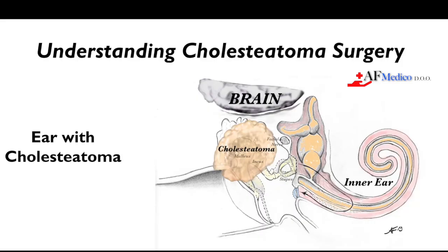And in this case, you will see the reconstruction and second look that also takes advantage of the posterior tympanotomy, but adds the use of an endoscope in order to get a very nice view into the hypotympanum and to the eustachian tube orifice area so that we can make sure there's no recurrence. And the endoscope also lets us check the position of the PORP.